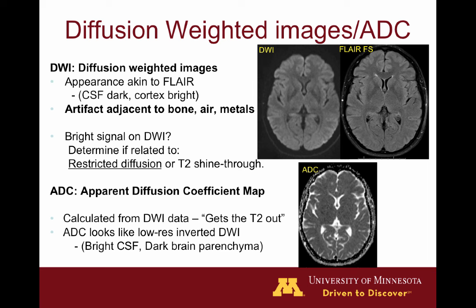Next we have diffusion-weighted images, often abbreviated as DWI. These images are a picture of the motion of water in several different planes — for standard DWI that's three planes. The signal characteristics of the brain look quite similar to a FLAIR sequence, especially when you apply fat saturation. The cortex is a little brighter than the white matter, and there's not much fluid signal. Our main job with this sequence is to determine whether or not there is restricted diffusion, as most bright signal on DWI is pathologic.